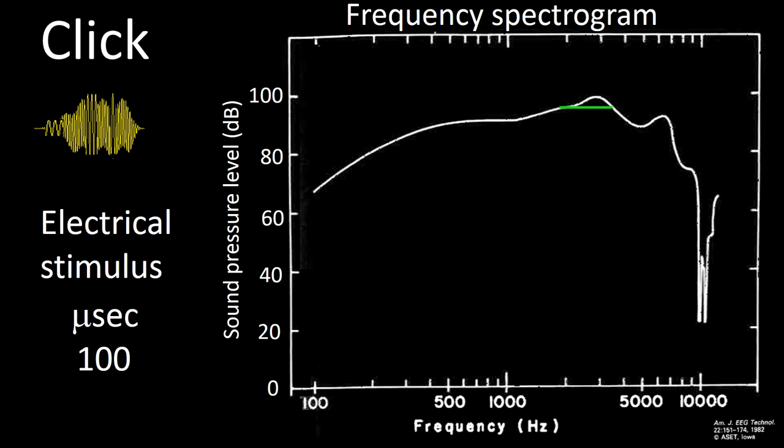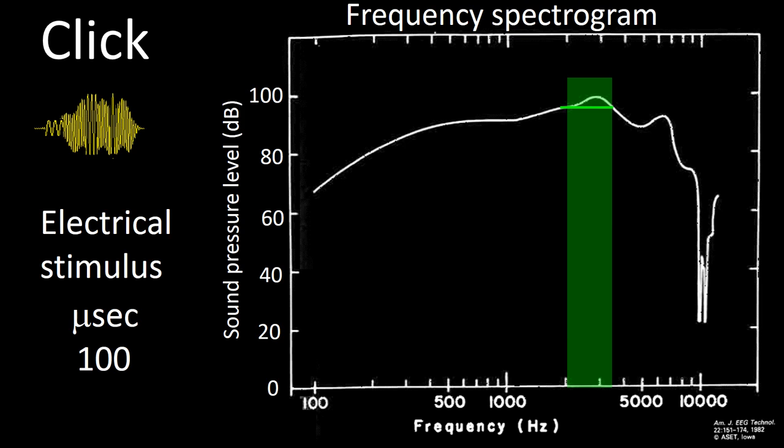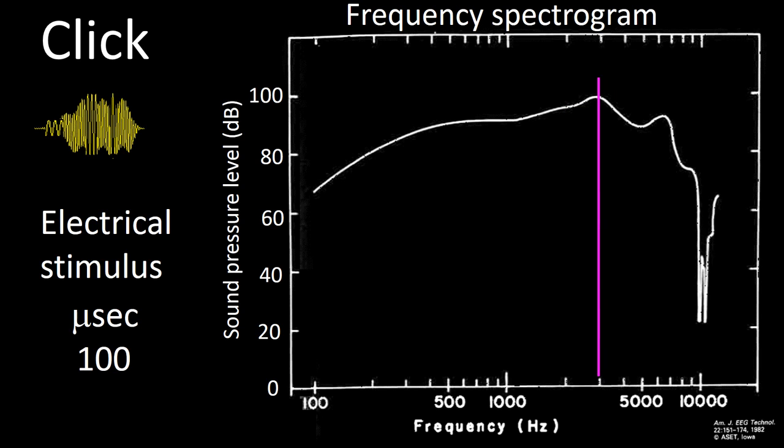The highest energy measured in decibel for this particular click is between 2000 and 4000 Hz. The maximal is precisely in this click at 3000 Hz.